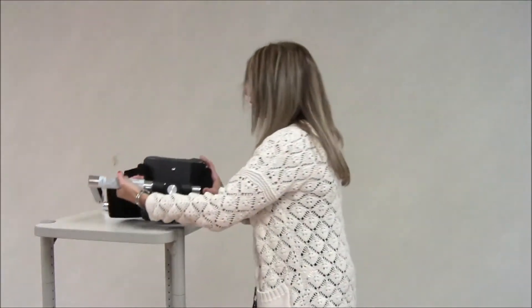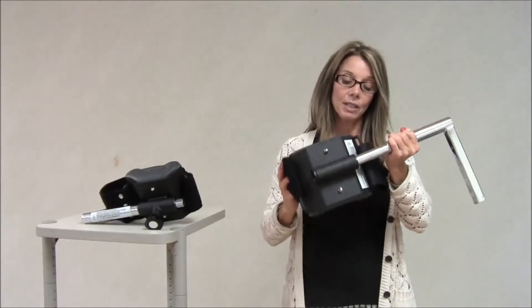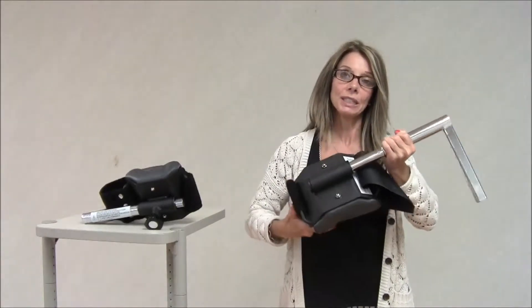On the adult attachment, there's no knob that can tighten or loosen the amount of swivel that you have in the attachment. And this one, as the other pediatric, it swivels 360 degrees.